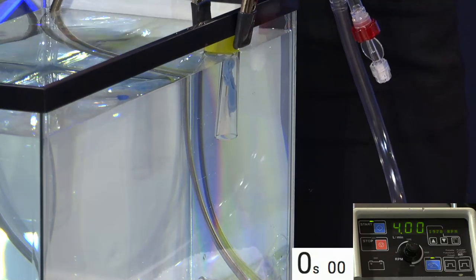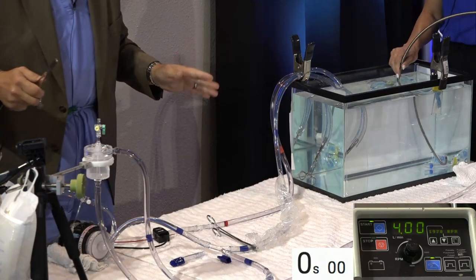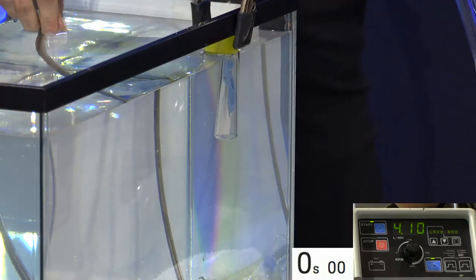And it'll stop pulling air. Yeah, that's fine. Okay, so we're back in business, all right? So we're on VA ECMO. Let's go ahead and start advancing.